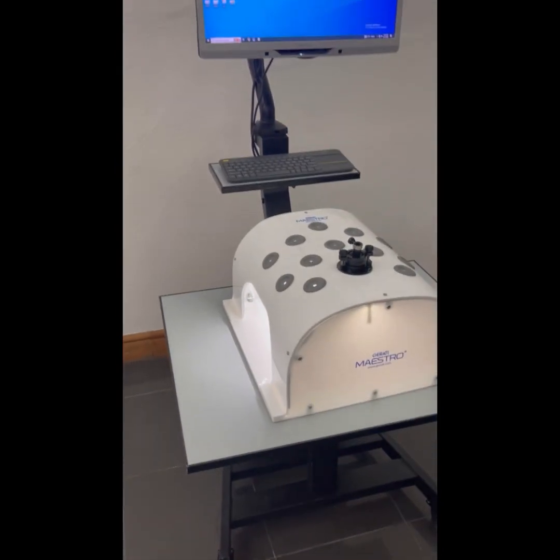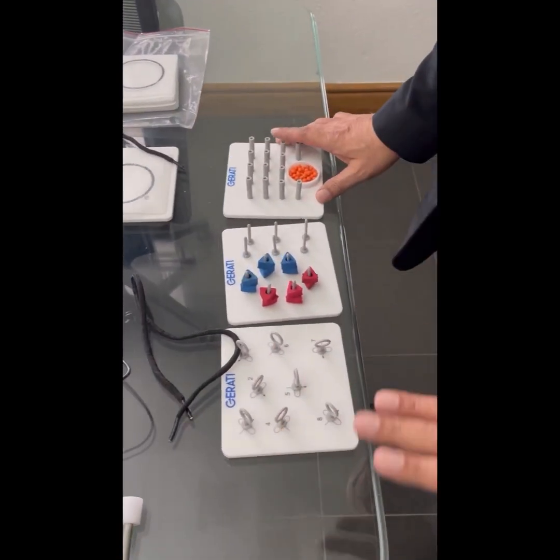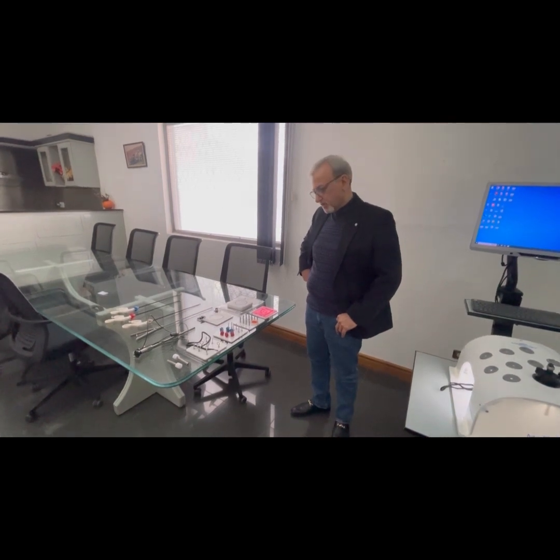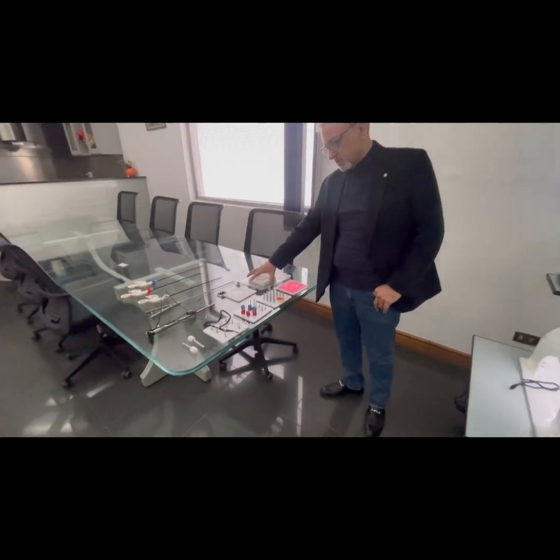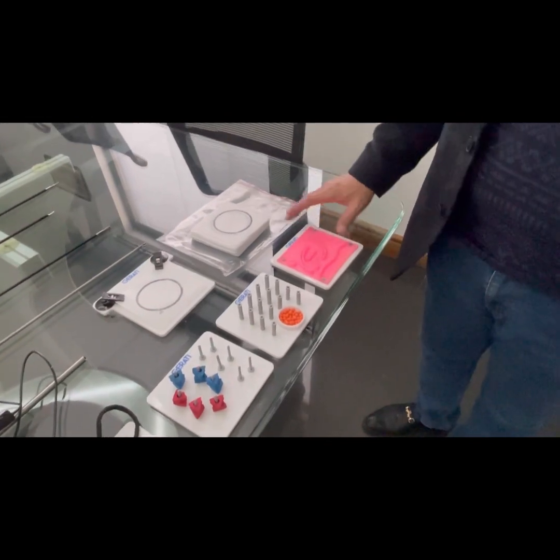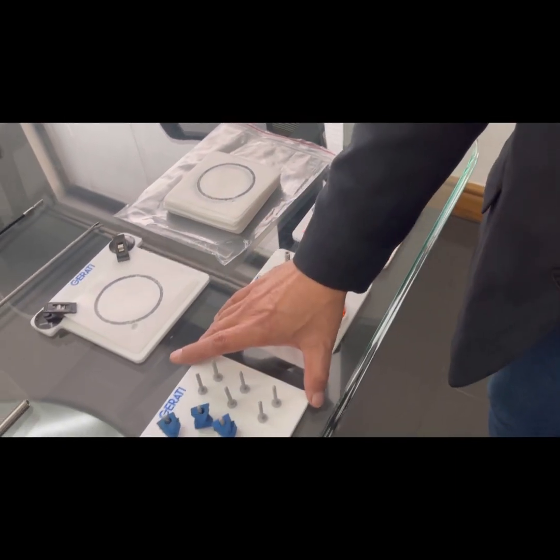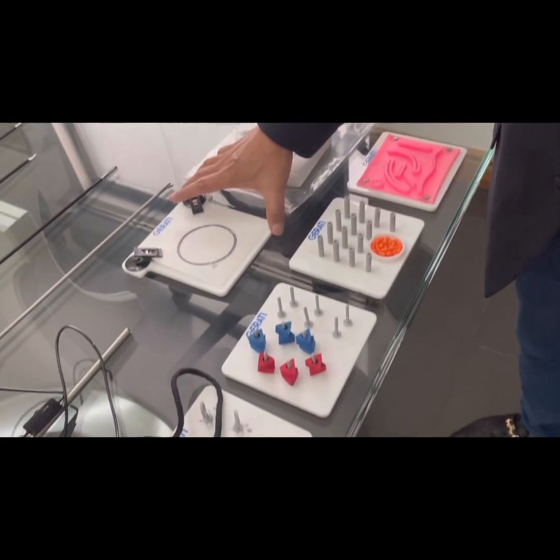Coming back to the exercises, we will present our different laparoscopic training tasks. We have our basic tasks here; the advanced tasks will be covered in a separate video. Our basic tasks include laparoscopic suturing pad, bead placement, peg transfer, thread hook, and cutting and dissecting exercises.